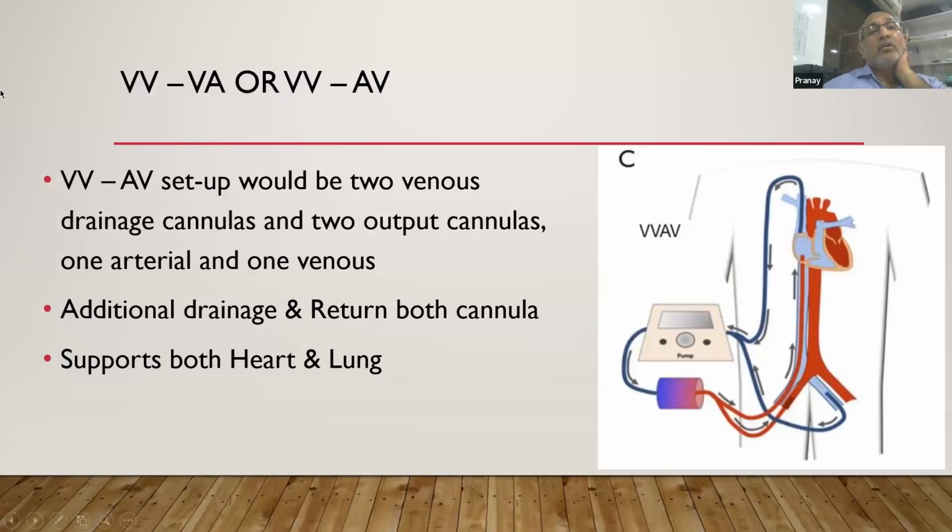Now, what is VVAV? It is both. When you require two drainage and two return cannulas, it becomes VVVA or VVAV, depending on which is the primary mode of initiation of ECMO.